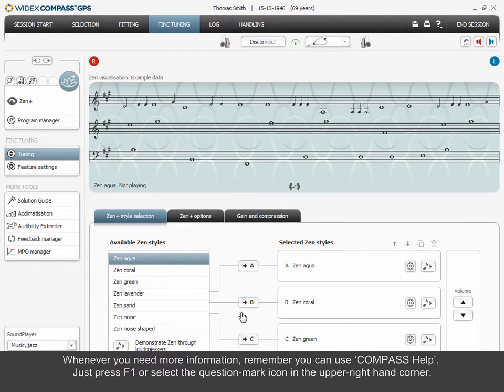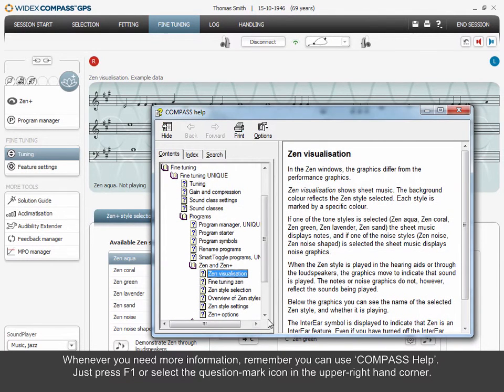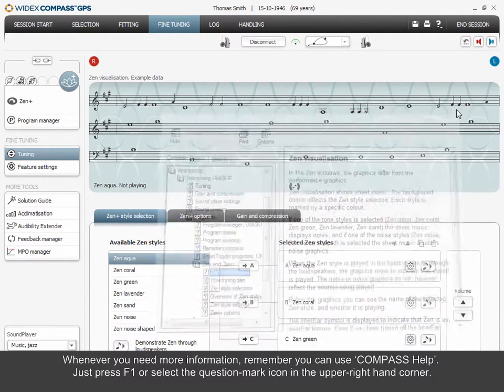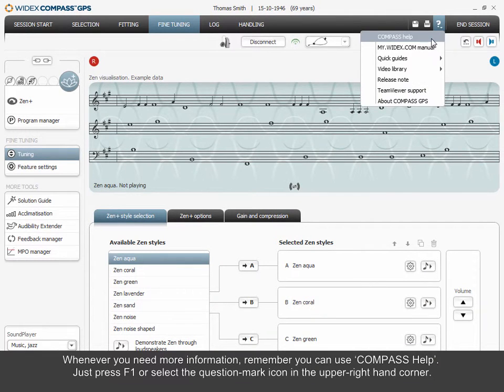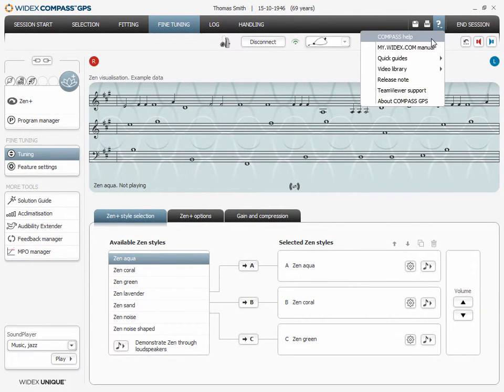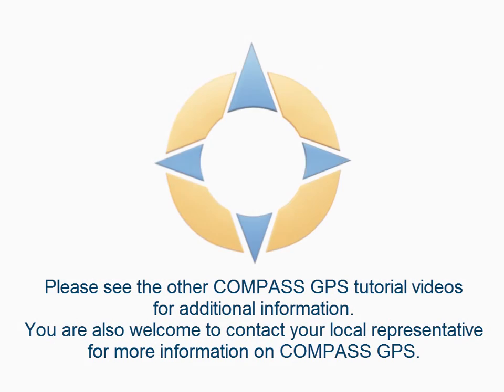Whenever you need more information, remember you can use Compass Help. Just press F1 or select the question mark icon in the upper right-hand corner. Thank you for your attention.